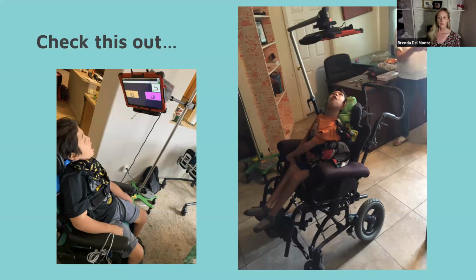But we're not placing that in front of him and expecting him to get into a position that we know he can't get into, which means you really have to trust the mount, don't you? If you're going to mount it over that kiddo's head, you've got to know that's not going to fall.